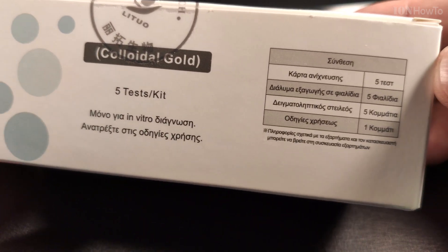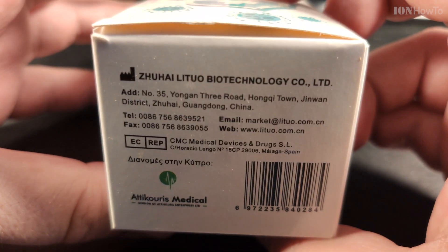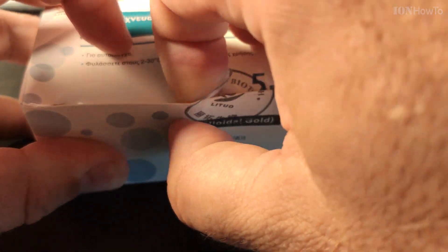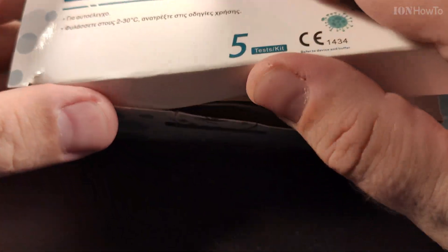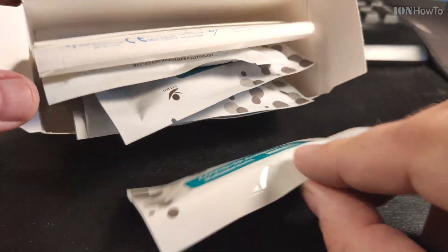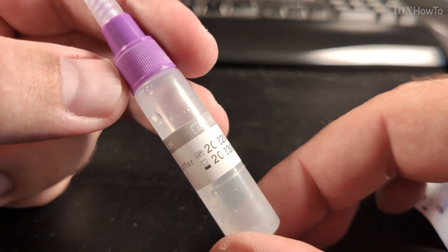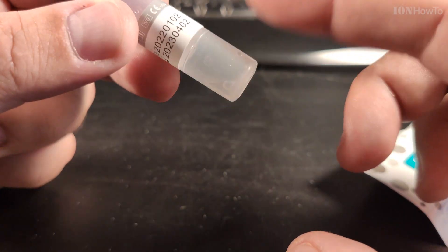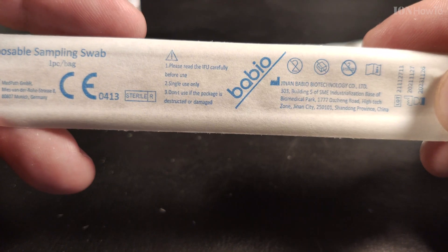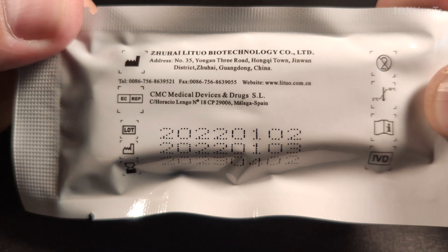In this video I will show you how to do a SARS-CoV-2 COVID-19 self-test. This is the colloidal gold test where a sample is mixed with the buffer solution. The buffer solution is included in the kit, which is designed for testing at home.